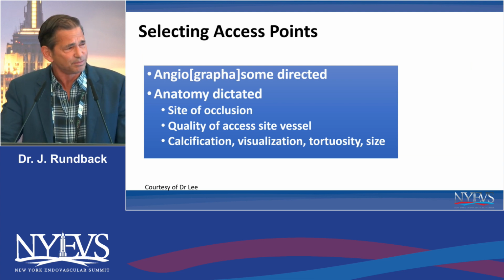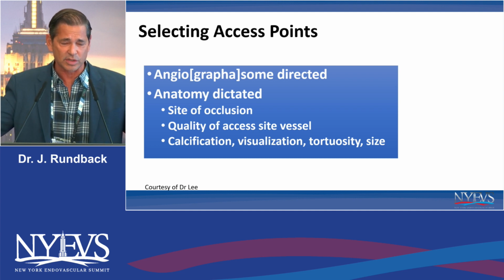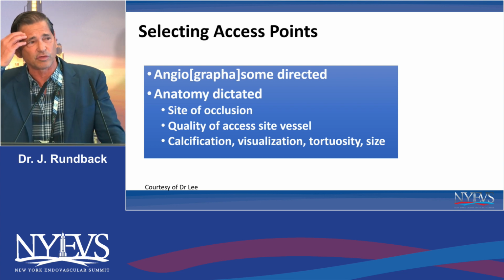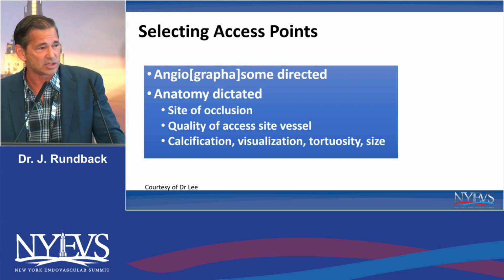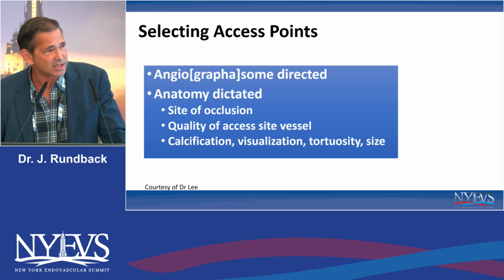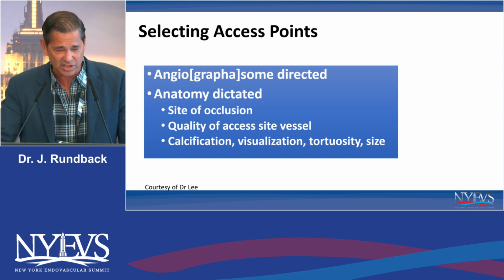So where do you go? So some years ago at Viva, I was asked to give a similar talk, and that talk was angiosome directed. And I don't like the word angiosome because angiosome is based on surgical free flap technology, which is sort of based on normal anatomy. But, obviously there's a lot of variation in patients who have diabetes and chronic kidney disease who don't form normal collaterals and have variations in anatomy.